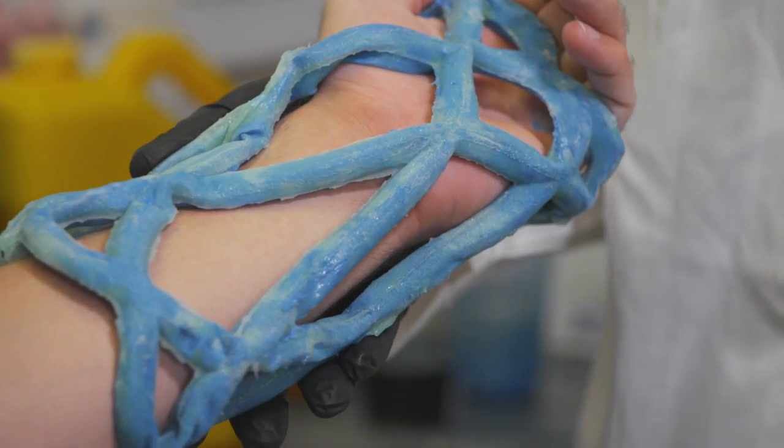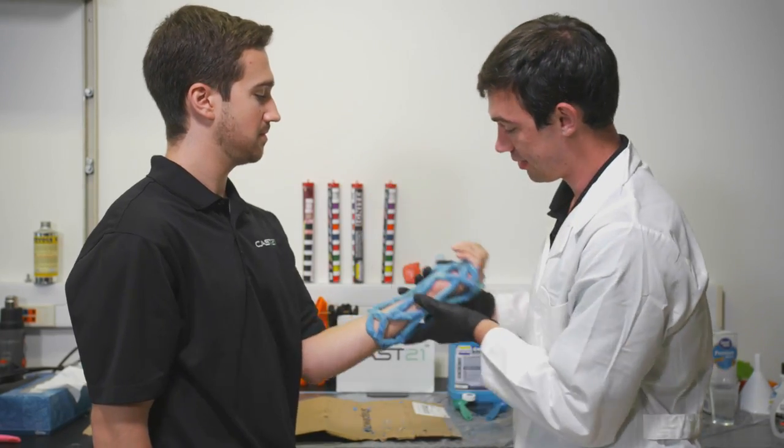We want to kill the old cast and make it so that the patients are a lot more comfortable, a lot more hygienic, and just have a better experience.